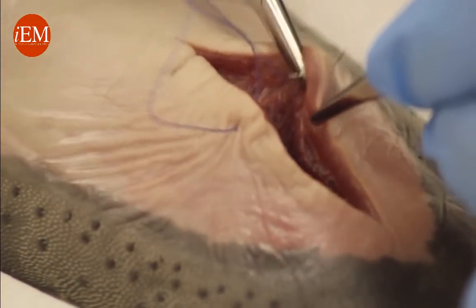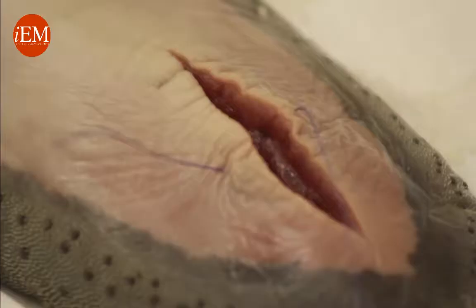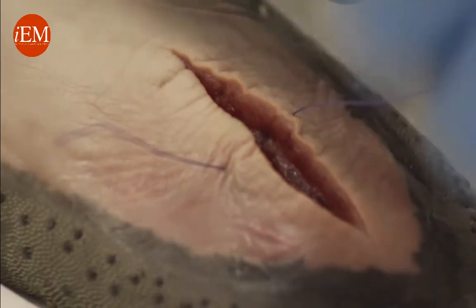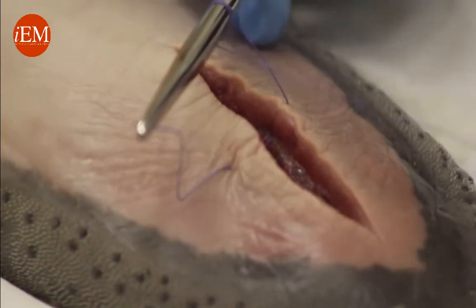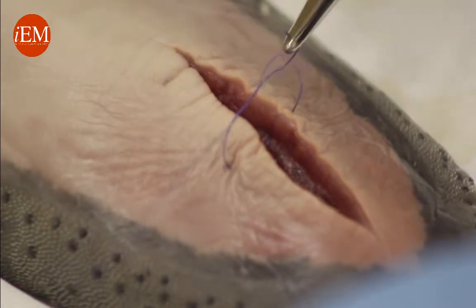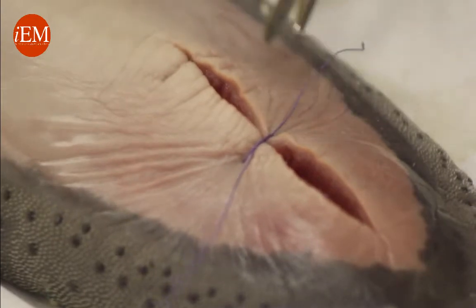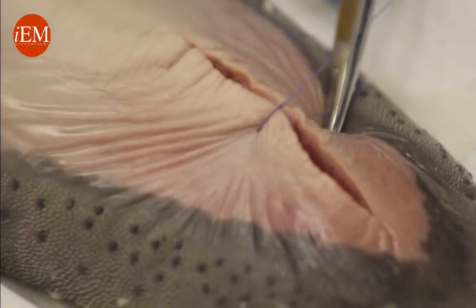Now we start the tie — wrap once, then twice, grab this end, and now we're going to pull. It becomes loose, so I'm going to pull again and lock the stitch.